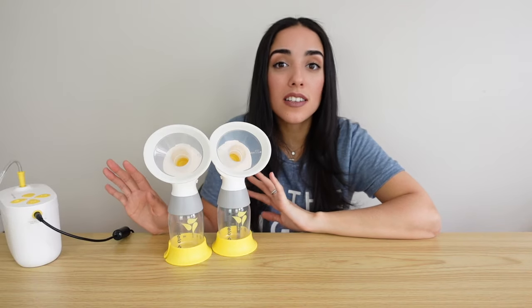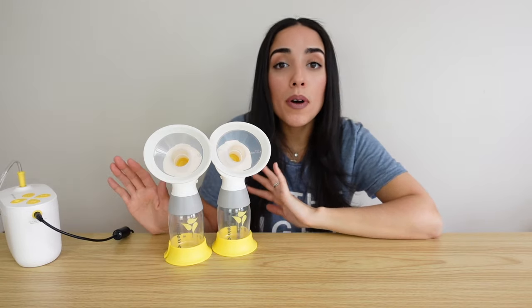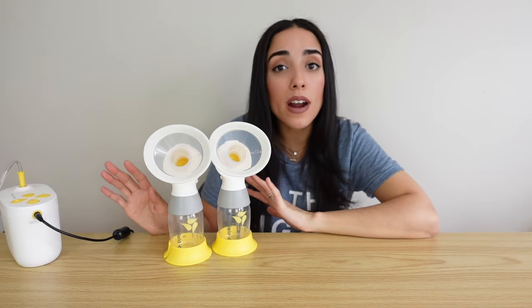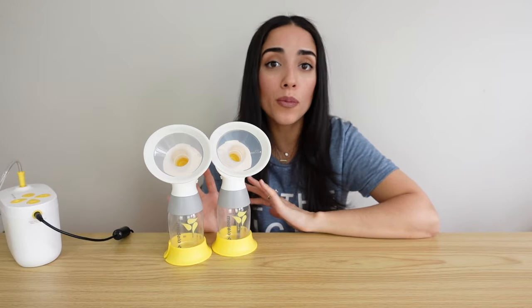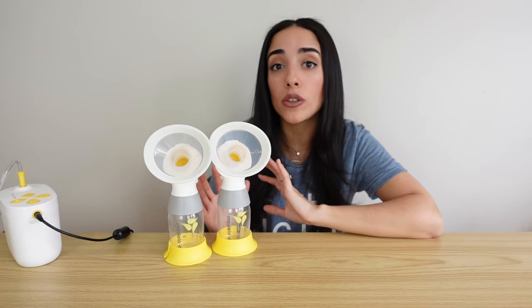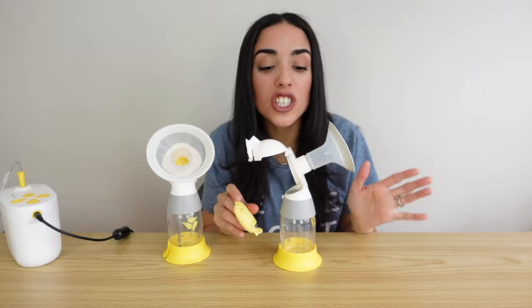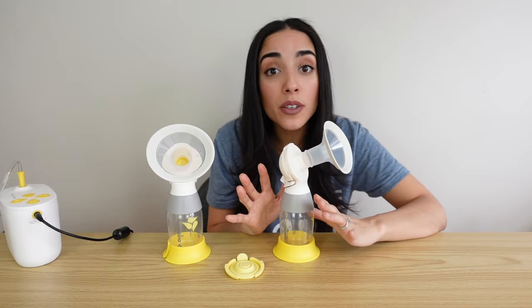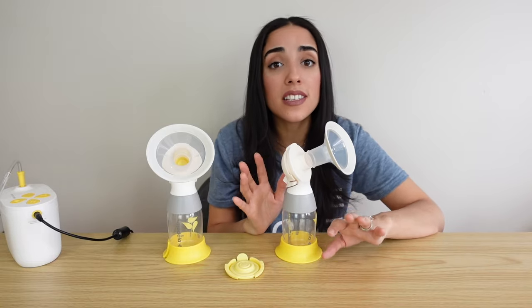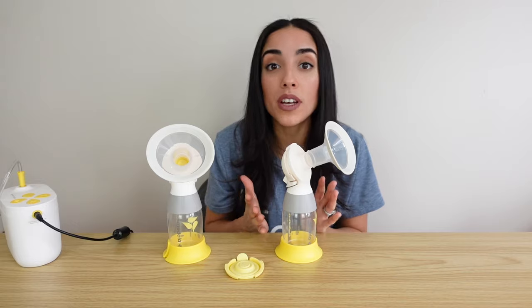Now let's talk about some pros and cons. Between the bag, cooler pack, lunchbox, and battery pack for wireless pumping, this pump provides everything you need for traveling and on-the-go portability. I also love that it comes with four bottles and four sealing caps with extra pieces included. The pump has a really simple and easy design making it super easy to take apart, wash, and put back together. I love using it when I'm in a rush — it's so easy to assemble and disassemble without worrying about lots of little valves and tiny pieces.